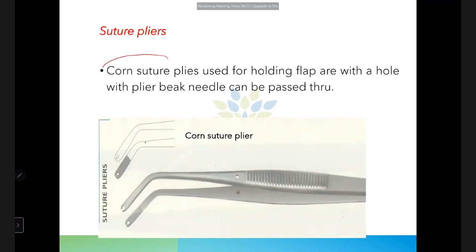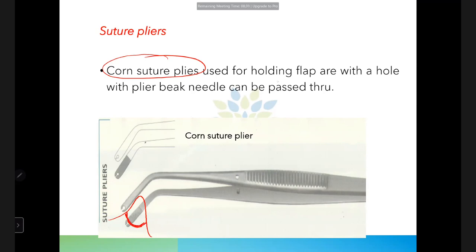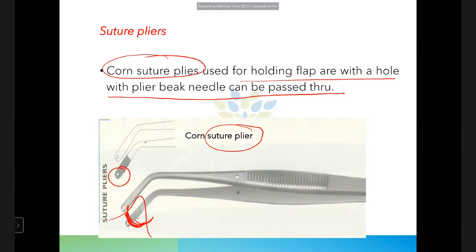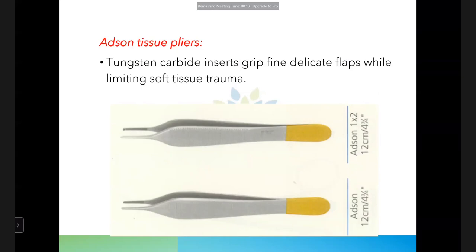Corn suture pliers are used for holding the flap during suturing. The plier beak has a hole through which the suture needle is passed, allowing the operator to hold the flap securely while placing sutures.